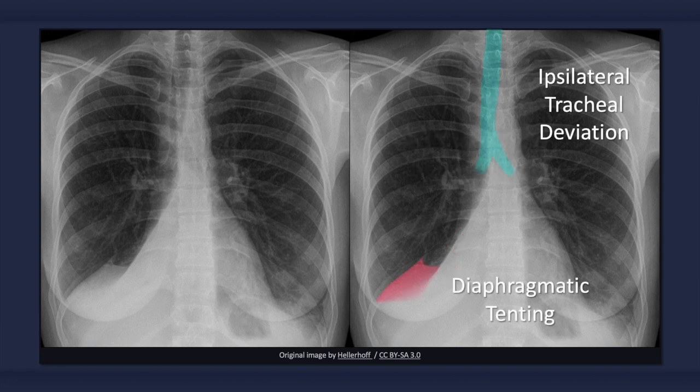Atelectasis may also result in signs of decreased lung volume, which can include ipsilateral tracheal deviation, depression of the minor fissure, and elevation of the right hemidiaphragm — a radiographic sign that is referred to as tenting.